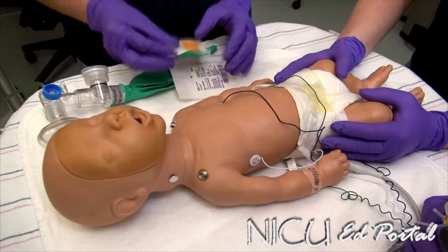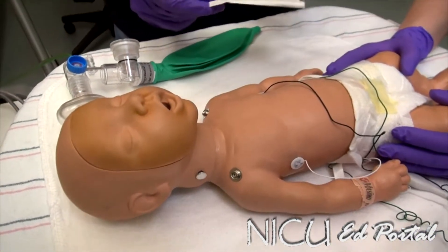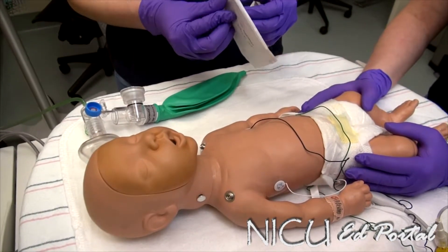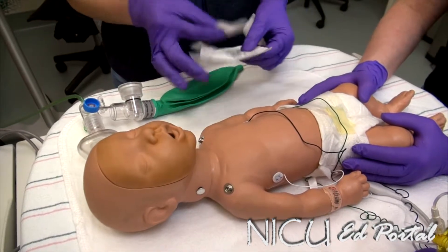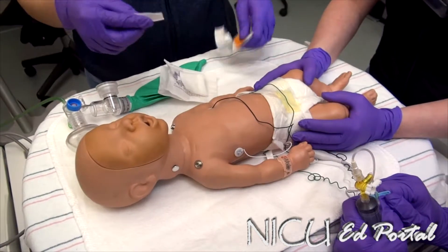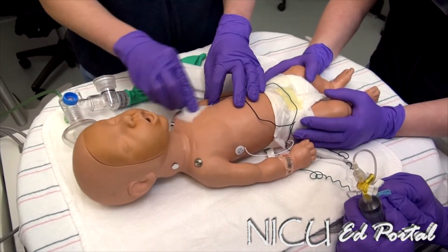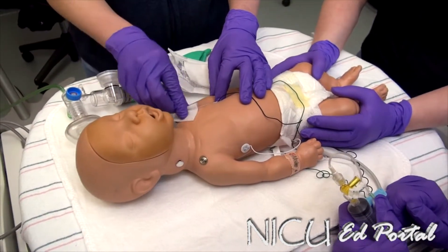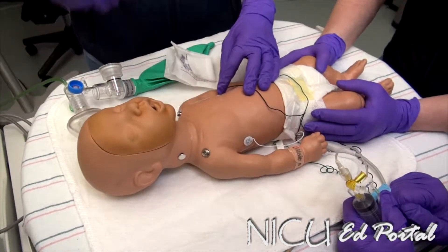First steps for a needle thoracentesis: clean the area. Open the gauze for afterwards. This is a clean procedure, so ensure that you have alcohol. Swab the area. The location we're going in is the mid-clavicular line in the second intercostal space. Make sure you're going above the rib to avoid the neurovascular structures.